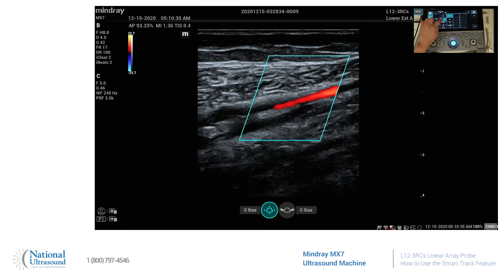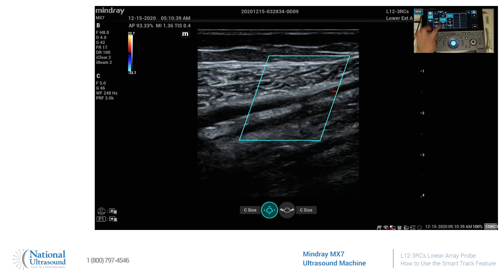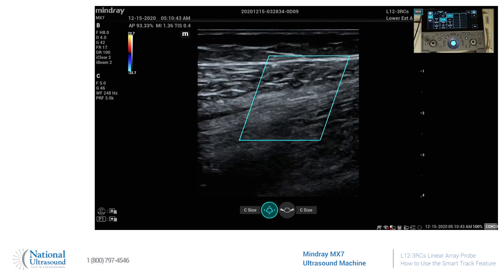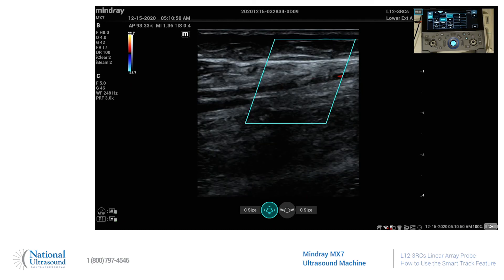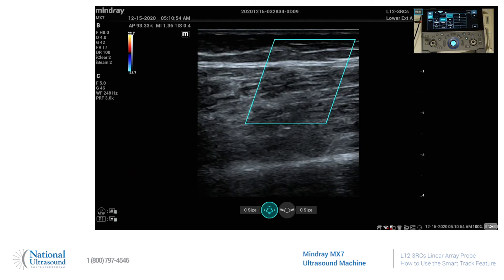The SmartTrack feature is up here on the touch screen. We can turn it on, and as you follow an artery, it's going to move the color box with you — so you don't have to adjust it. It's just going to follow you as you go down the artery.